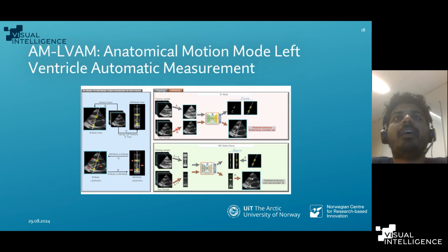So this work is very intuitive, since the problem from the fully automatic approaches that we discussed is overestimation or underestimation, because the predicted landmarks are not perfect. Precise landmark placement does not happen because of the imperfect heat maps, and from a clinical perspective, we need landmarks on a single line, which we call a scan line.